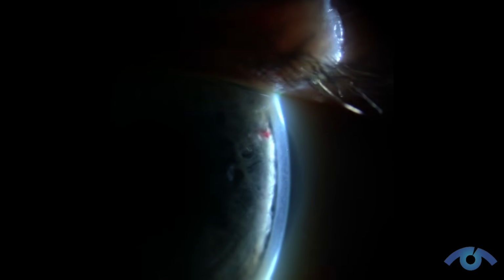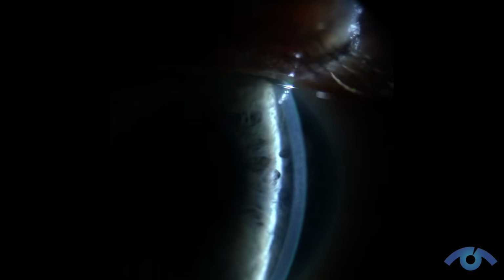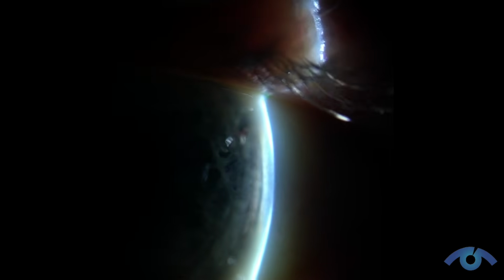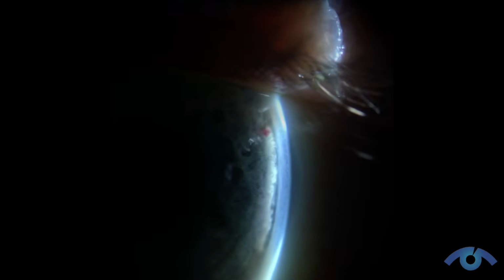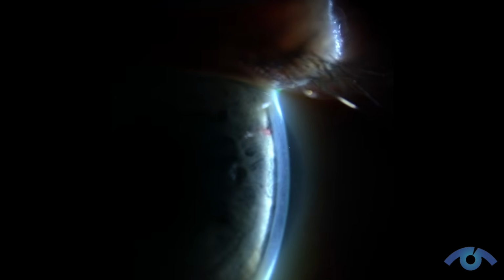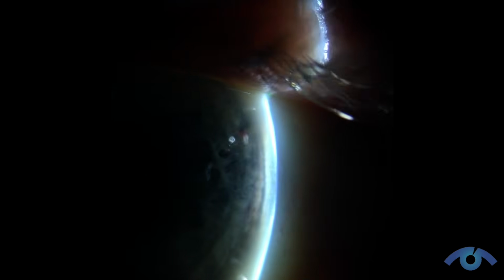This is the other same patient's left eye, and you can see the hole superior, and there's actually a little hemorrhage next to it. This is a patient that had an LPI 1 week before this video was taken. So doing the LPI sometimes can make the anterior chamber a little bit deeper, but that's not a guarantee that it's going to change the curvature of the iris. It just creates ancillary flow. In the event that the angle were to start to close, that ancillary flow would help to decrease the risk of a complete angle closure.